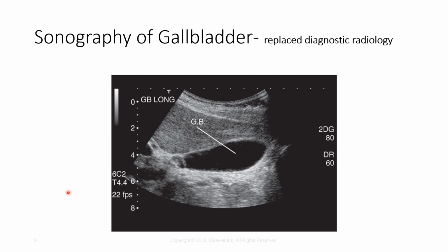Sonography does not use ionizing radiation, which is better for the patient, lower patient dose. Sonography can detect much smaller calculi or stones than radiographic imaging can. There's no contrast media used in that exam, and there's less patient prep. Typically, patients having an ultrasound would just need to be NPO, or nothing by mouth, for at least 8 hours prior to the exam, and then they could have the sonogram, which would show smaller stones without using radiation. No contrast media is required and less patient prep, so all around better for the patient.